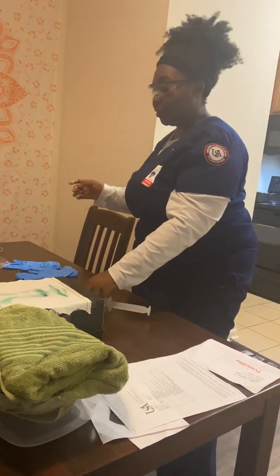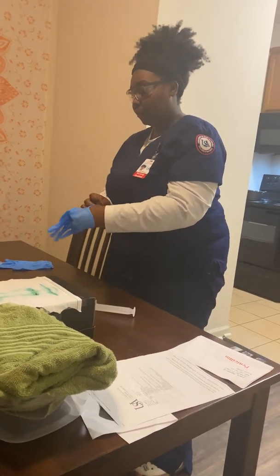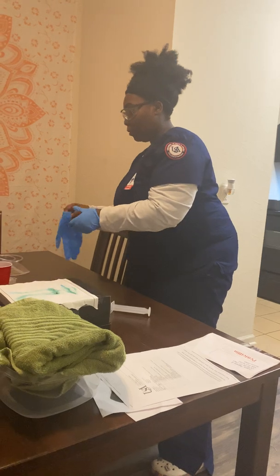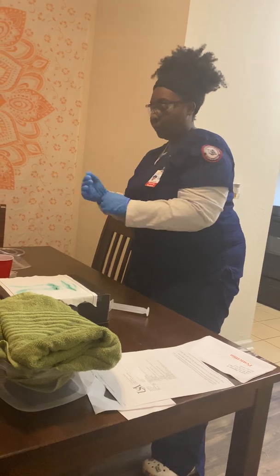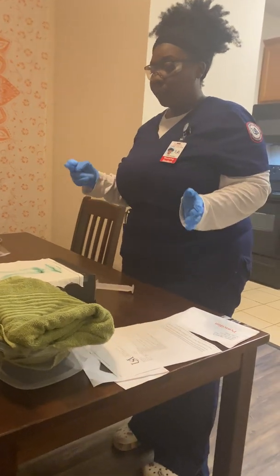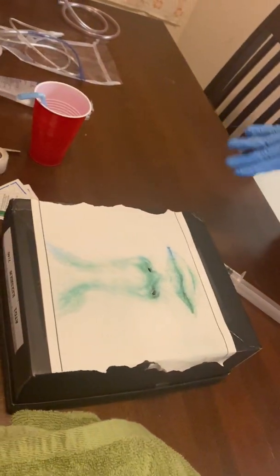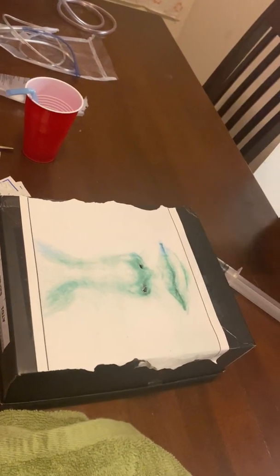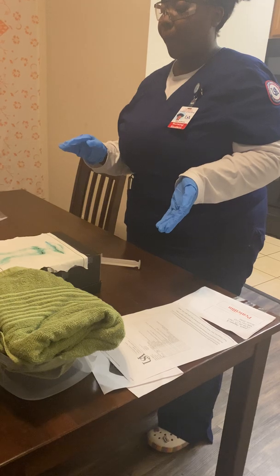And then I'm going to don my clean gloves. While I'm donning my clean gloves, I'm also going to get ready to assess which nostril I will be using. So I'm going to cover and have my patient sniff both nostrils. Okay, so today I'll be using the right. And then I will verbalize that after I have done that, I would wipe the center of the nose with either alcohol prep or soap and water and pat dry.